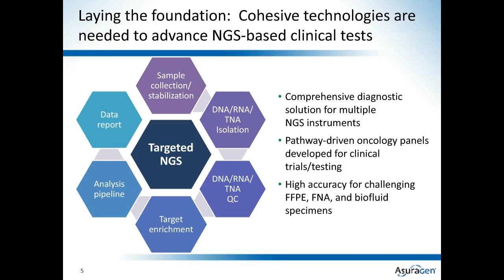for clinical applications. But in addition to linking all these pieces together, it's also important to integrate across different segments of the assay. And one of the points that I'd really like to highlight today is how our ability to interrogate the quantitative characteristics of the sample itself, that information can be used to inform the analysis pipeline so we can get much more reliable data.